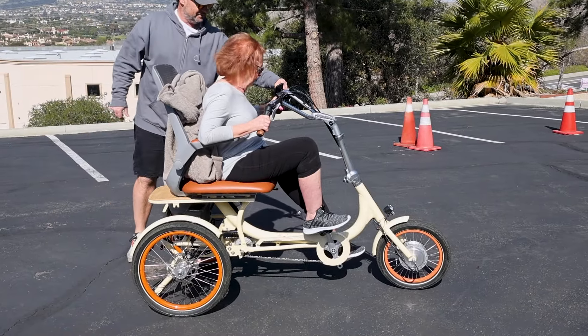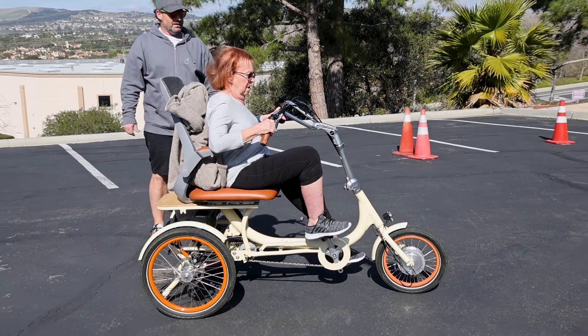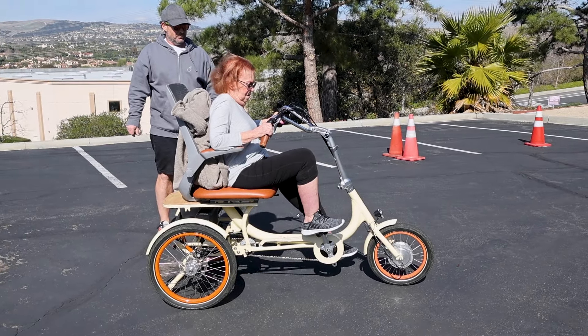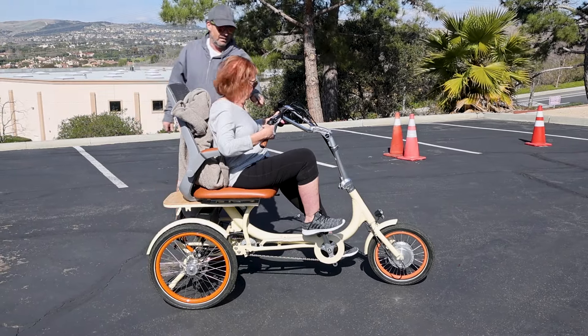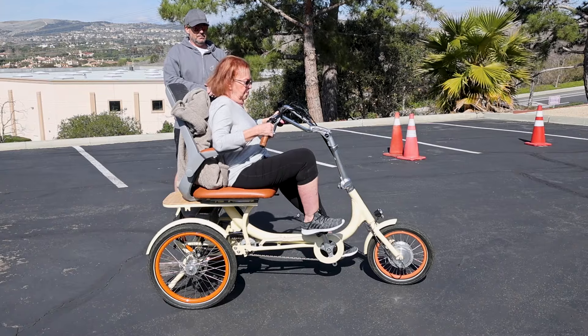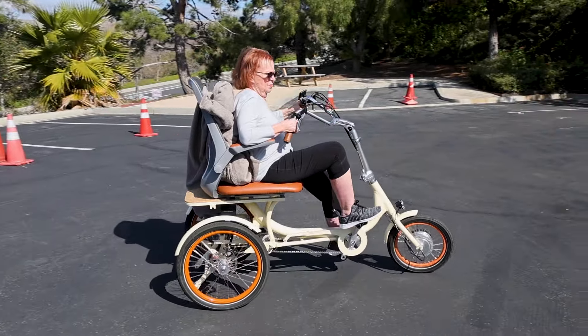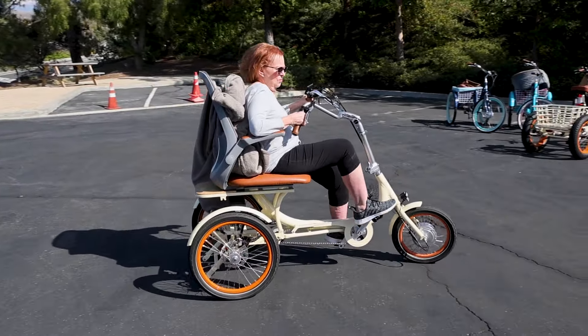Use the throttle — give it a little bit. This is the kill switch, so push that first, then give it a little throttle. There you go. You can utilize the throttle to get up and down hills and to navigate tight spaces.